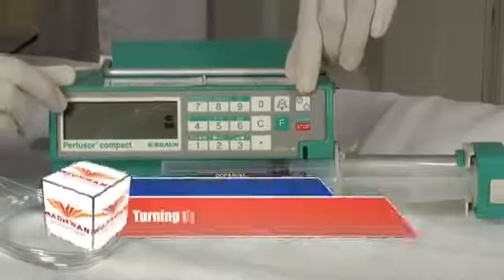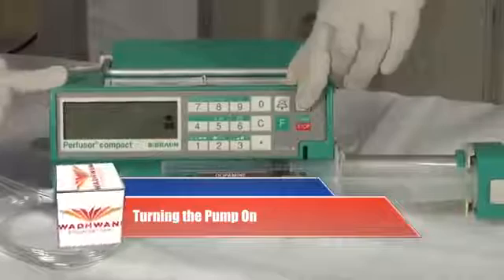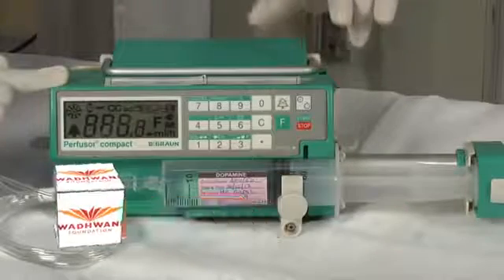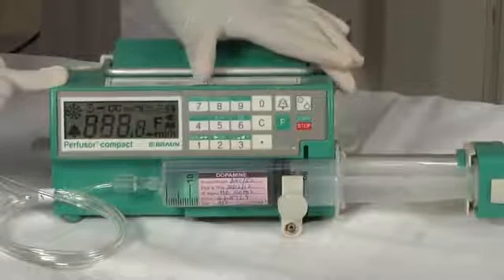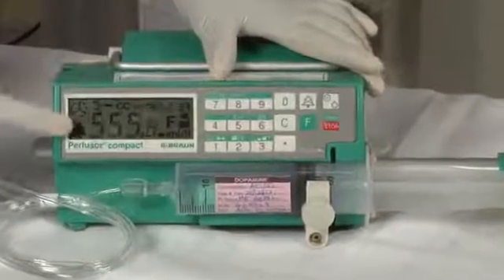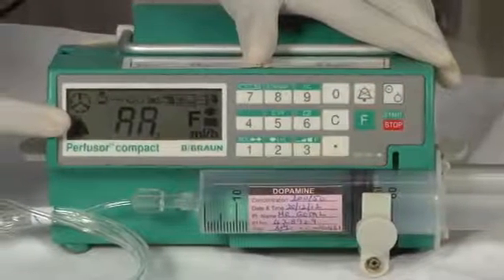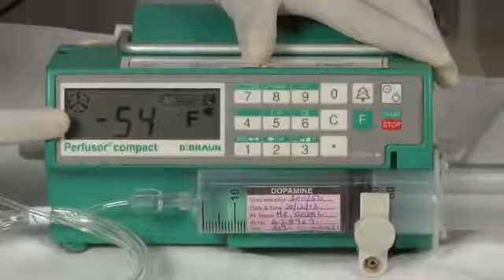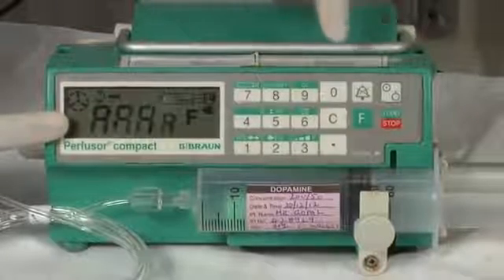Turn the pump on. To switch on the pump, we press the on button on the keypad. The moment you switch on the pump, it goes through the self-test showing various characters on the display. When the self-test is complete, it shows AAA and minus 54 alternatively.